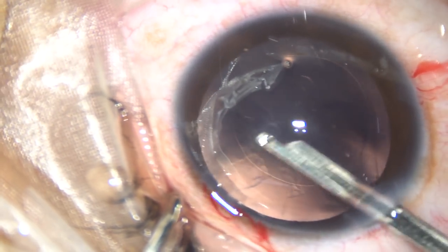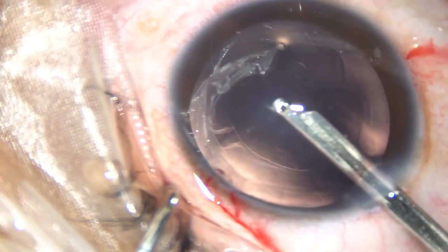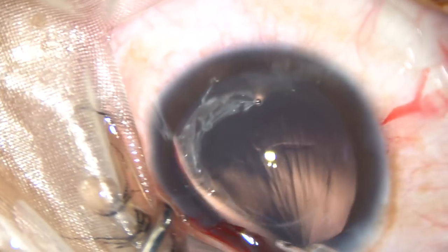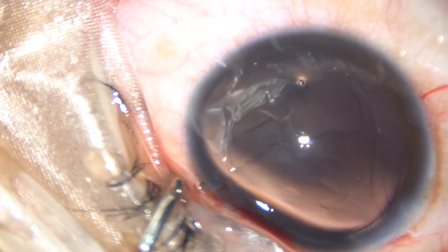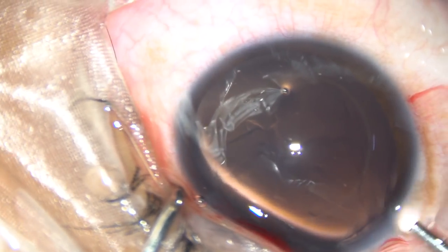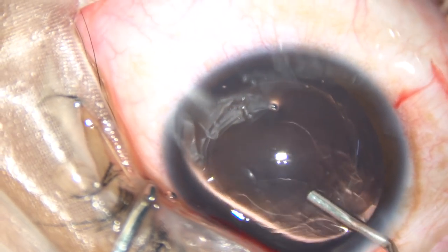The lens material is removed. And now some lens fibers are sticking to the posterior capsule, so the posterior capsule has to be polished very nicely. And what is hydropolish? You use a fluid jet to polish the posterior capsule.